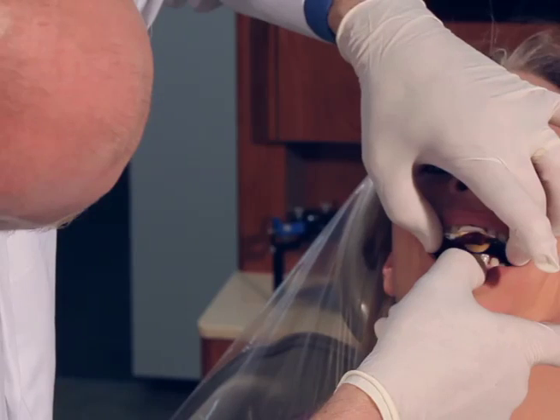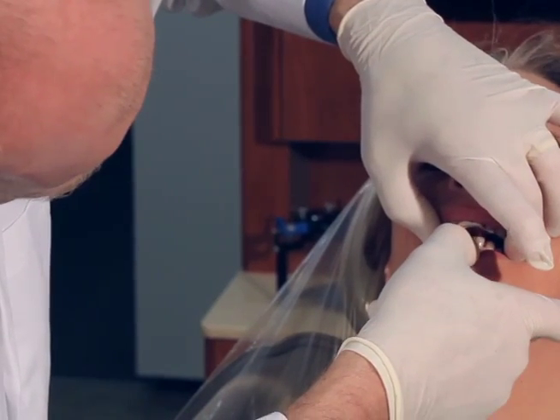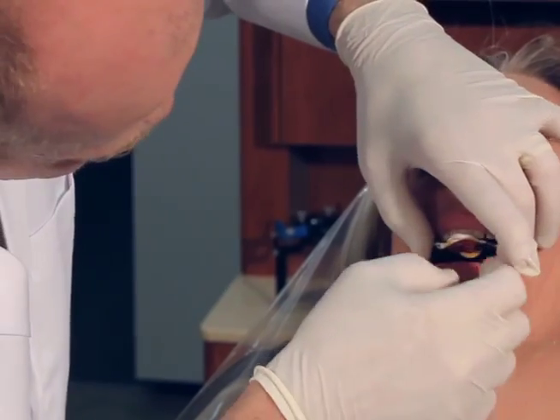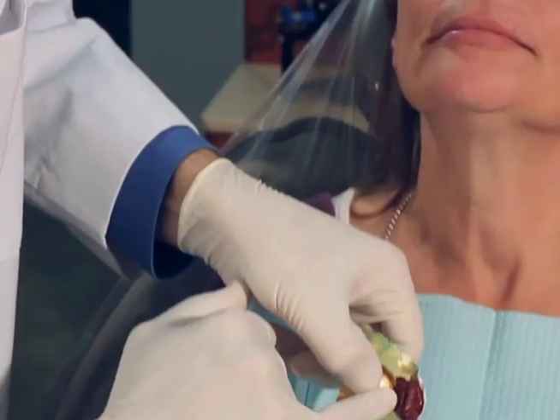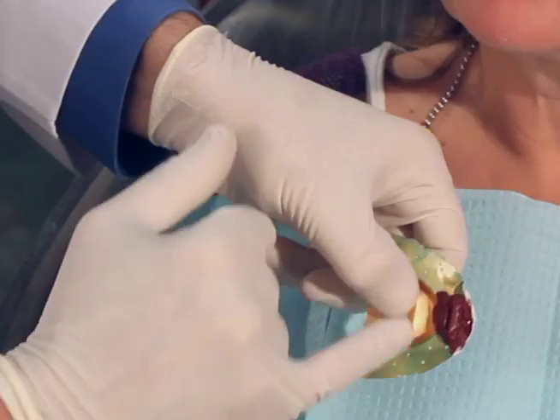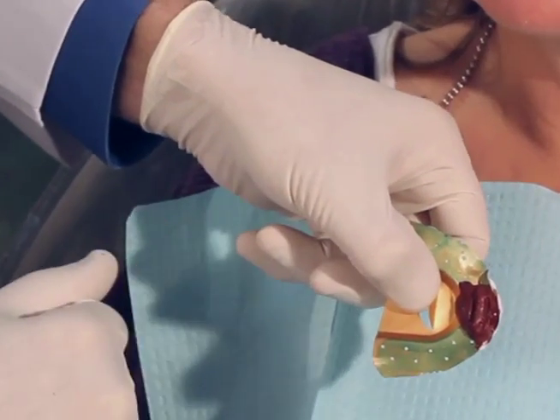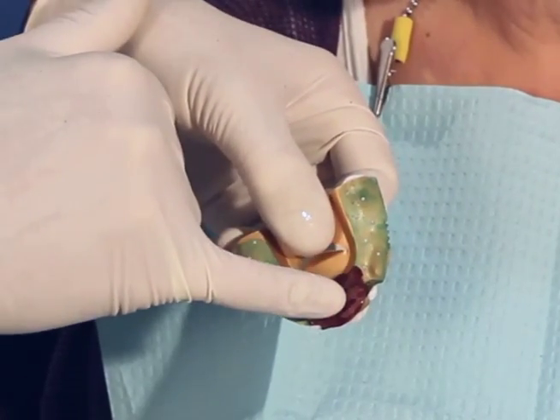Stop. Open. Now come forward — slide forward, slide forward, and up. Open. I'll take this out. We can see we have both a centric index and a protrusive index. I'm going to go ahead and chill this with cold water and shave this back a little bit with a sharp scalpel. Now we can see both the centric index and the protrusive index. We like to go between five to seven millimeters forward, which this is approximately five millimeters.